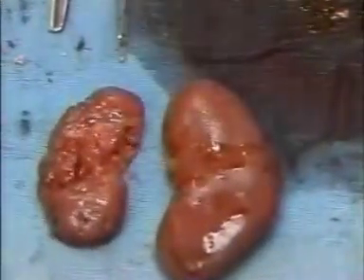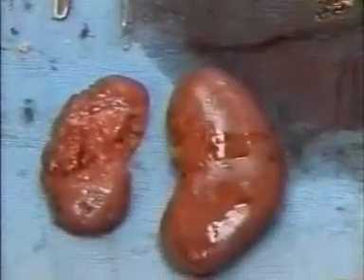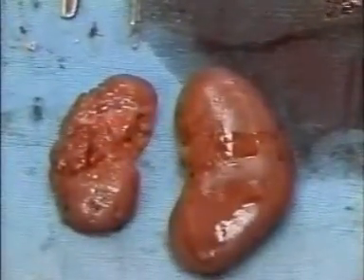These are the kidneys. Remember that the left kidney was the one which had all of the scarring and is markedly shrunken in... That was the right kidney. Was it right? Pardon me. It was markedly shrunken in comparison to the right side.